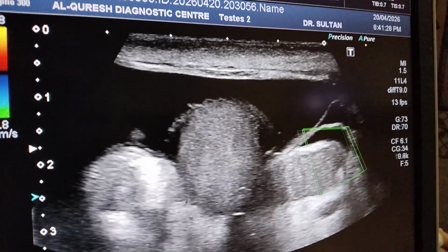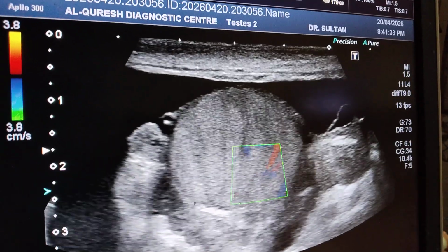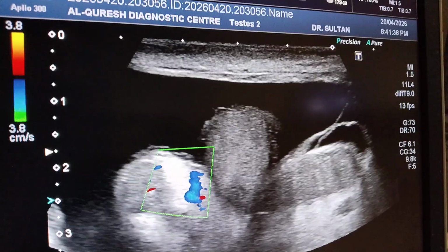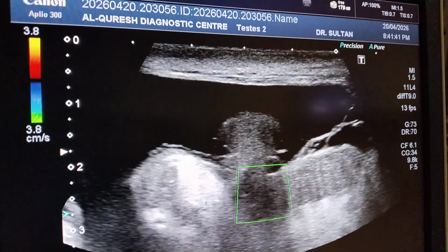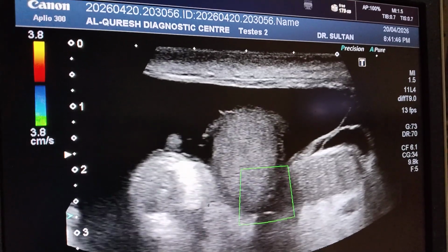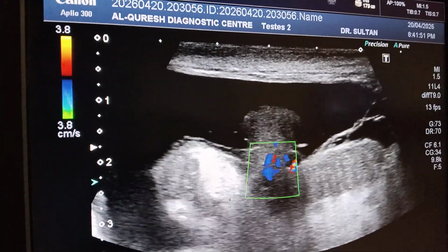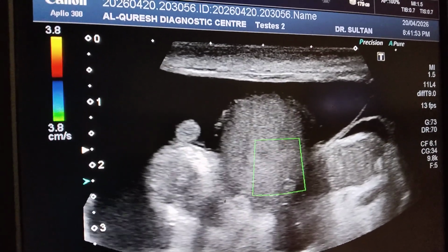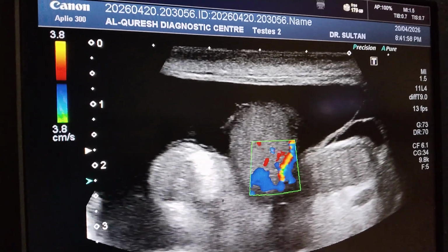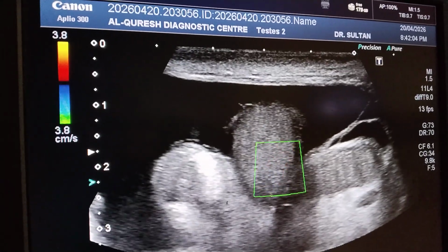So we can say that orchitis and inflammation of the appendix are present while there is developing inflammation of the left epididymis. So epididymitis is also developing. The history is of 2 days, so this patient may also have epididymitis. So we can say that this patient will go into epididymo-orchitis and also have inflammation of the appendix.